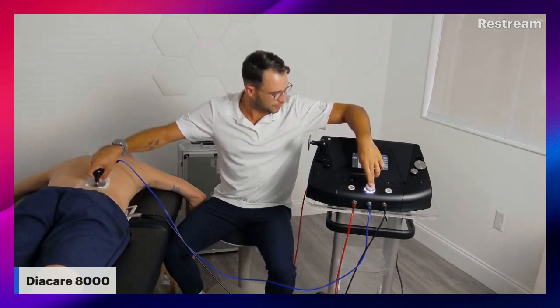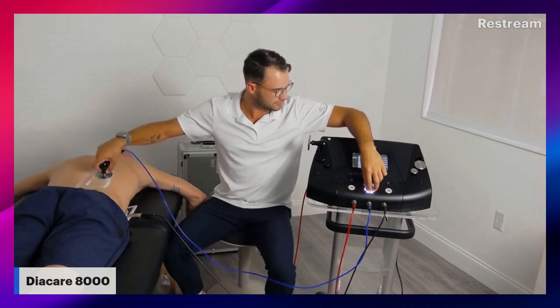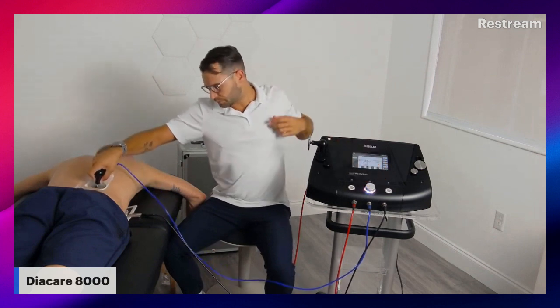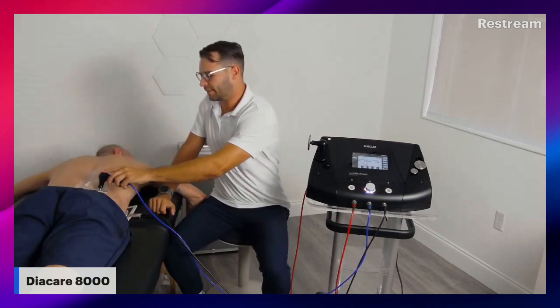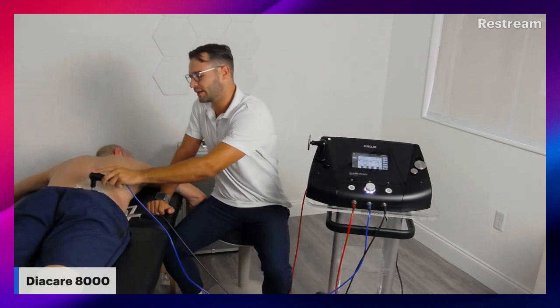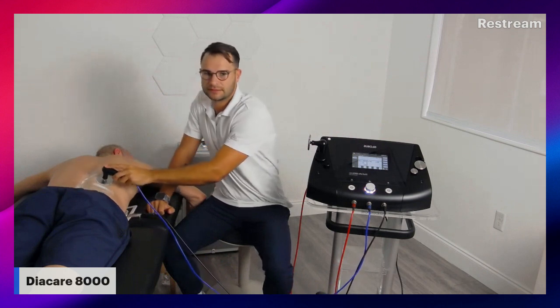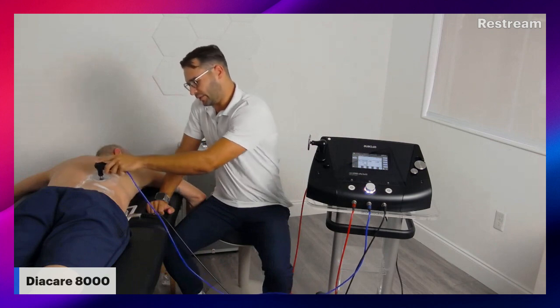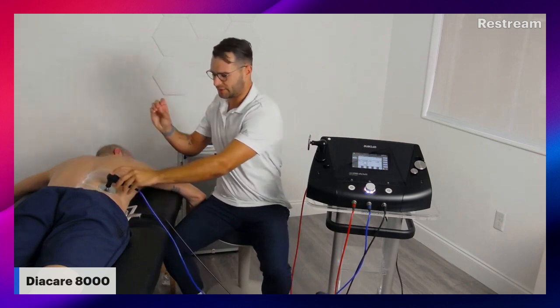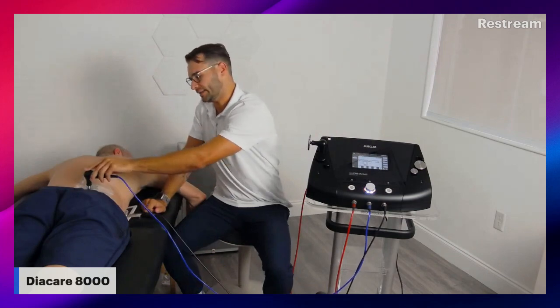We're going to start by turning up the intensity, moving the head of the electrode around. And this time, as we were saying before, we're going to be going after those deeper structures. We're going to be targeting the areas with the most impedance. So wherever the most impedance is, that energy is going to get bound up, and it's going to create more heat in that area.